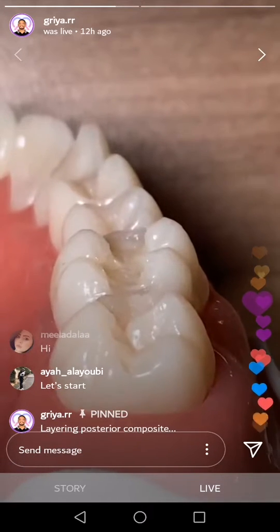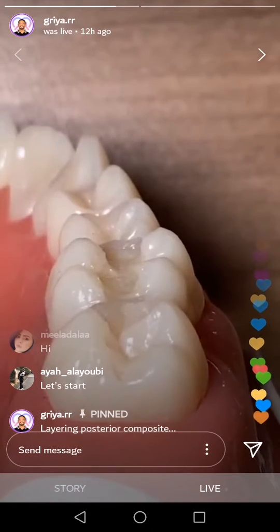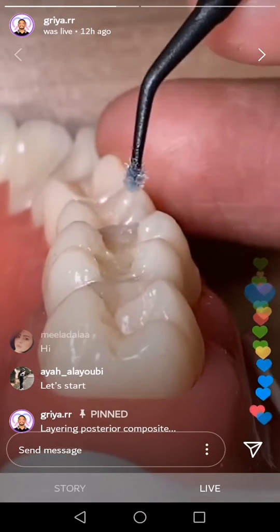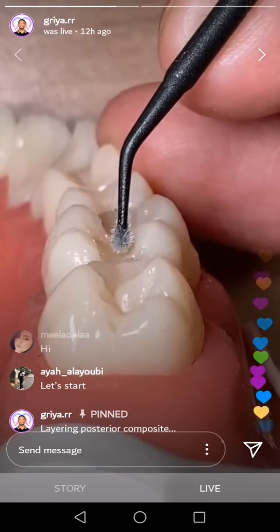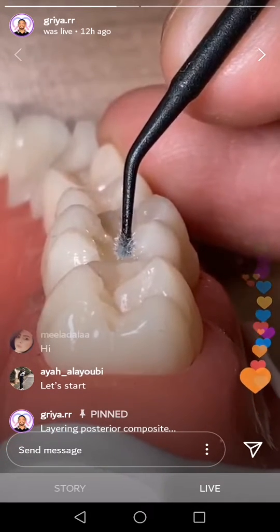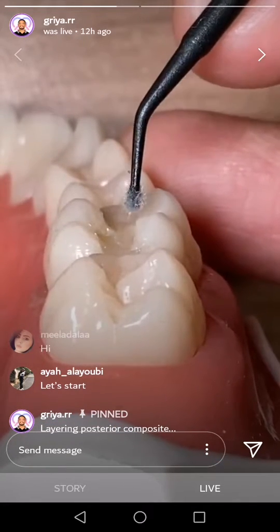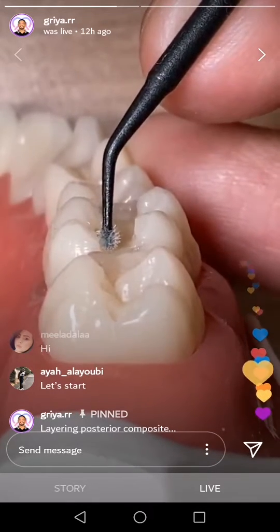If you don't have a probe? Okay, if you don't have a probe, you can use your microbrush. Okay, this is your microbrush. If you have all the microbrush surface already, one microbrush like this, one, and then one, and then one.